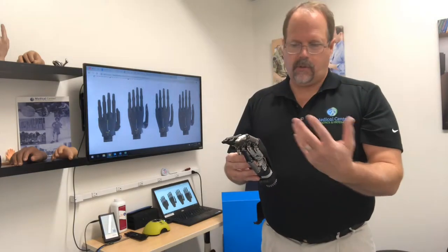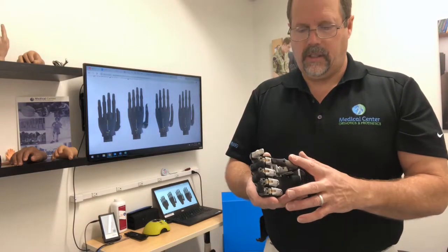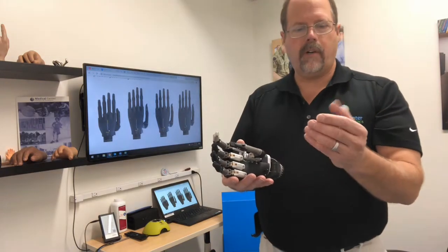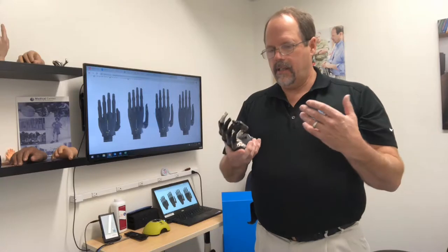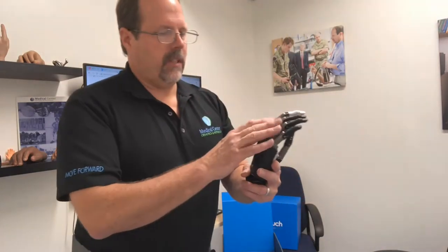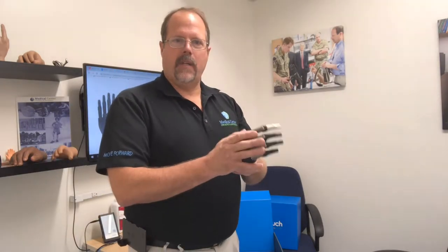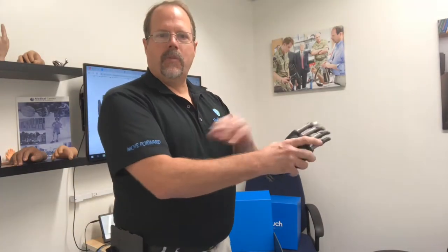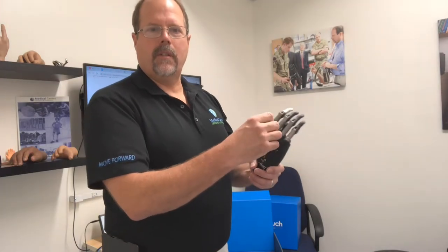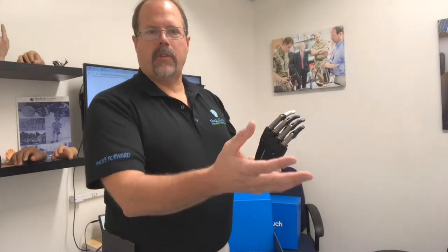The iLimb Quantum Titanium is what's considered a multi-articulating hand. There are motors in each finger, including the thumb — actually, the thumb has two motors, one for flexion-extension and one for abduction and adduction. Touch Bionics has a little processor in here so, with those different motors, we can pre-program 24 different grasps. The user can select four out of any of the 24 grasps at any one time. They have four different ways to change the grasps using their EMG signals or myoelectric signals off the muscles, and they can do different types of contractions: co-contraction, hold open, double impulse, or triple impulse.